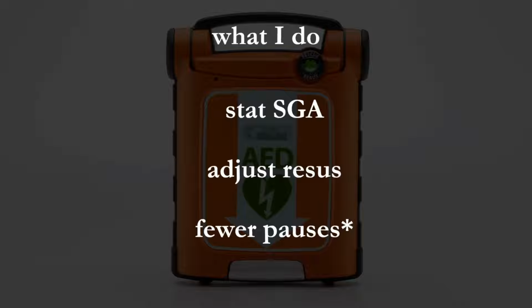Unless you don't trust the end tidal device, you can probably forego at least some of your pulse checks and then maintain a little bit better perfusion pressure. Bear in mind with that, though, there's a tendency, obviously, to use a lot of bicarb in cardiac arrest. Whether we should be or not is also outside the scope of this discussion. But if they're in an ultra low flow state, if any of that bicarb metabolizes to CO2 and still reaches the end tidal sensor, it will make the end tidal jump, and you may have a false reassurance that you have return of spontaneous circulation. So just bear that in mind when you're monitoring this value.